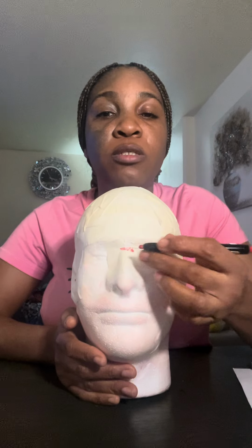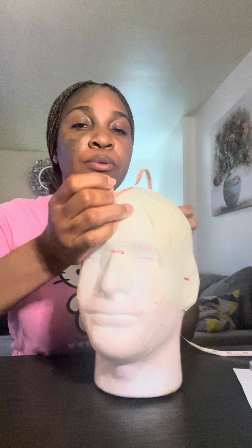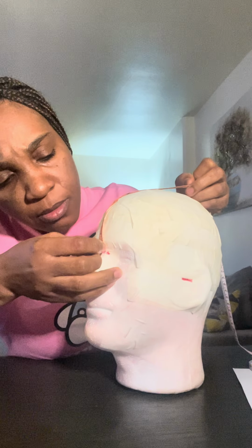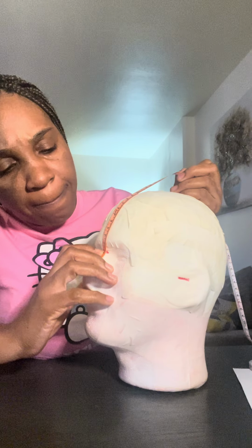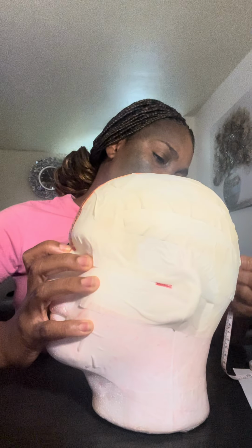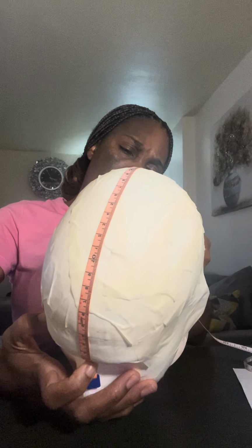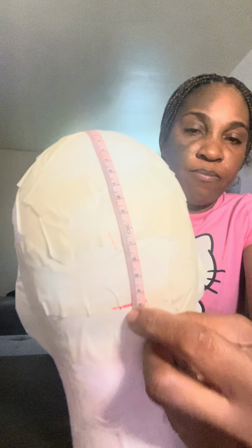The first measurement of the 10-20 system is the sagittal measurement, which is from the Nasion to the Inion. I'm going to take the total measurement, putting my tape on the 0 mark on the Nasion, going through the middle, back to the Inion. From Nasion to Inion, I have 35.